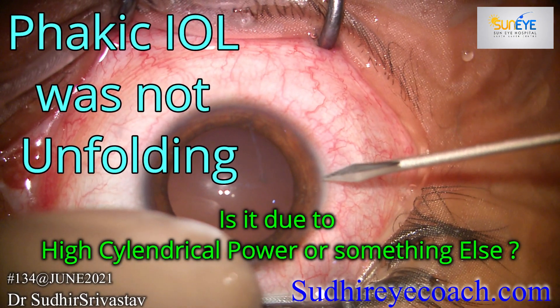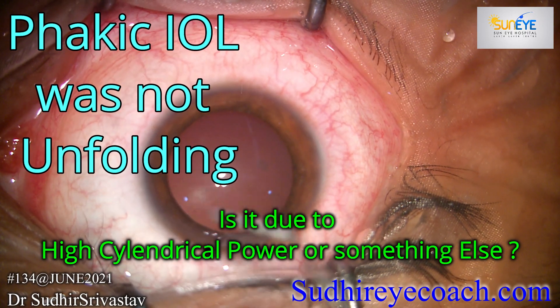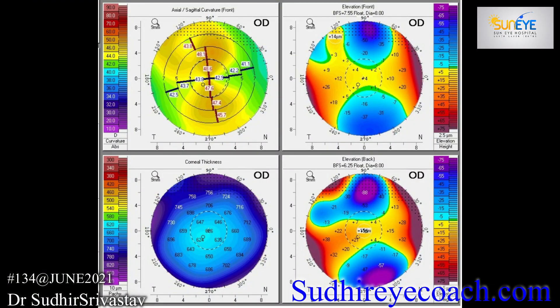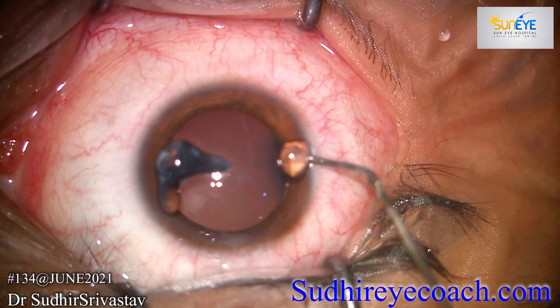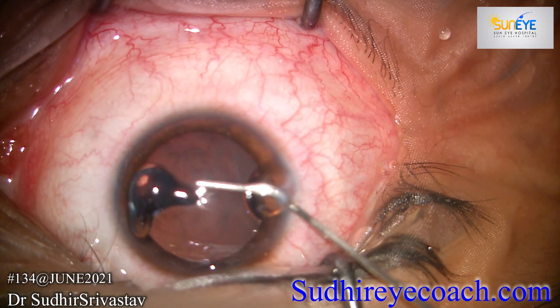Hello everyone. Sometimes a phakic ICL does not unfold quickly. What could be the reasons? Is it related with the power of the lens or something else? Pentacam shows high cylindrical astigmatism — astigmatism was around 5 diopters. Anterior chamber depth was sufficient and this case was not fit for laser correction, so we have taken this case for phakic ICL implantation.